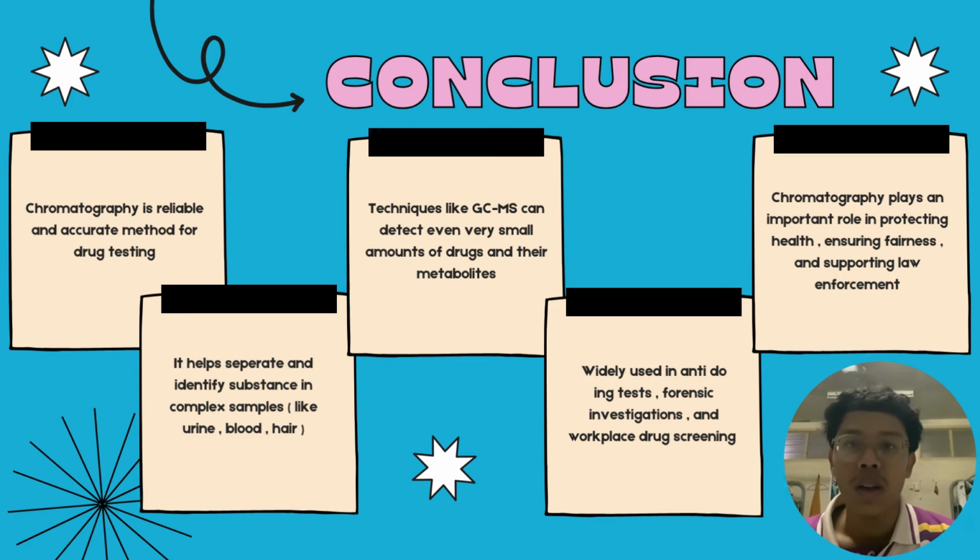This makes chromatography a powerful tool, especially in situations that require high sensitivity like anti-doping tests, forensic investigation, and workplace drug screening.